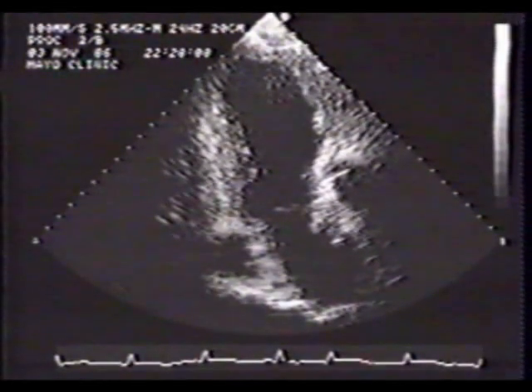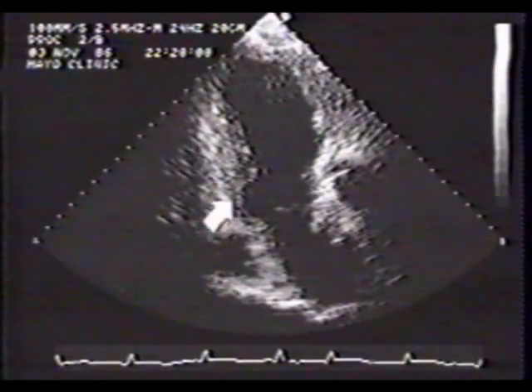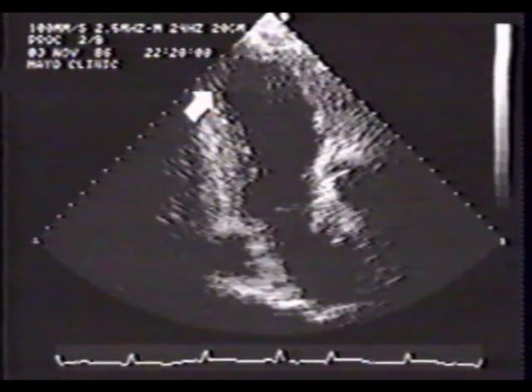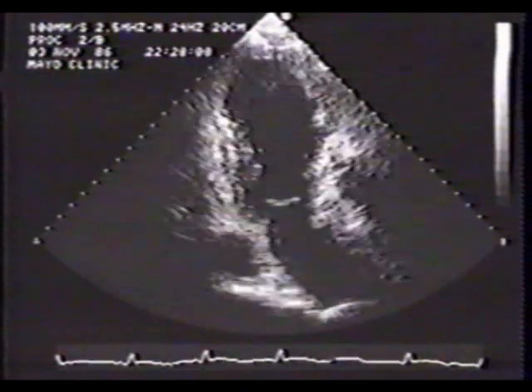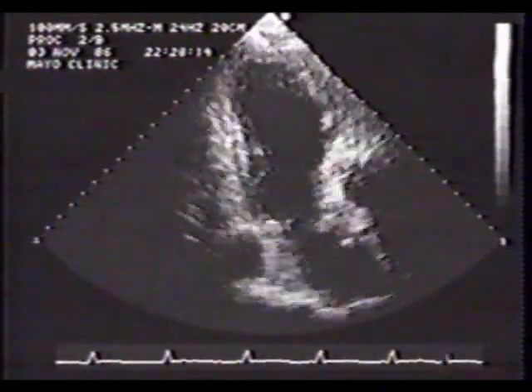The transducer has been further rotated to the apical two-chamber view. This is the descending thoracic aorta. In real time, the inferior wall will contract normally at the base and mid-levels. The anterior wall and the inferoapical segment will be markedly dyskinetic. Remember that the LAD not only supplies the anterior wall and anterior septum, but also usually hooks over the apex to supply this inferoapical segment. Based on all views, the score index for this large anterior infarct is 2.4.